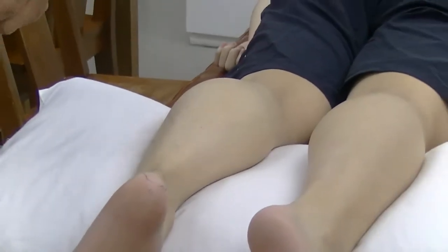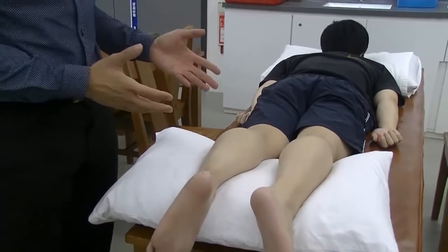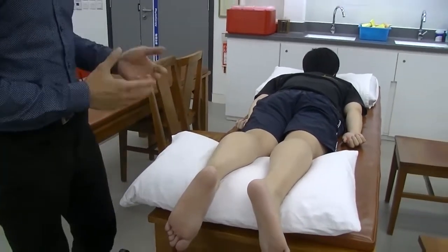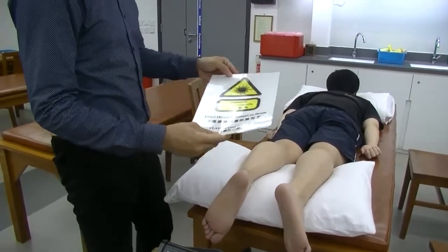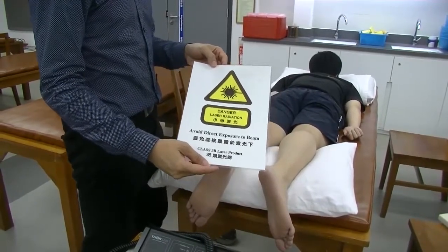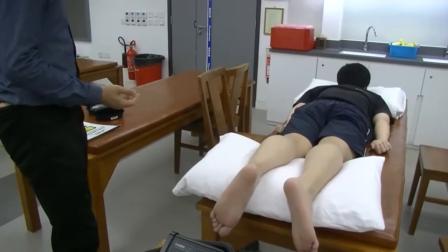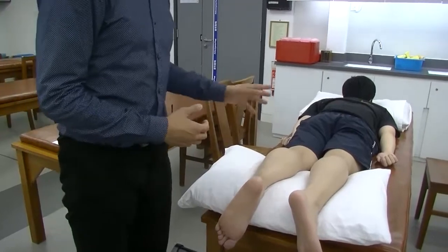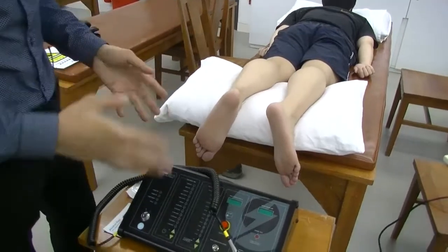The patient has been positioned and is wearing goggles. Even though it is unlikely the patient can see the laser beam, we must check all contraindications and precautions and remind the patient about laser safety. We also need to place a warning sign outside the treatment area to ensure no one enters during treatment, and confirm the patient is comfortable.